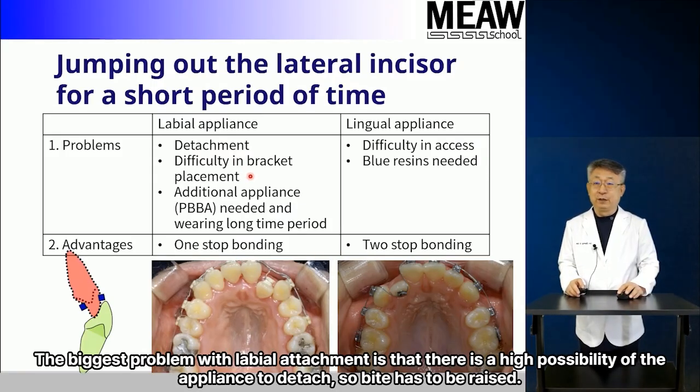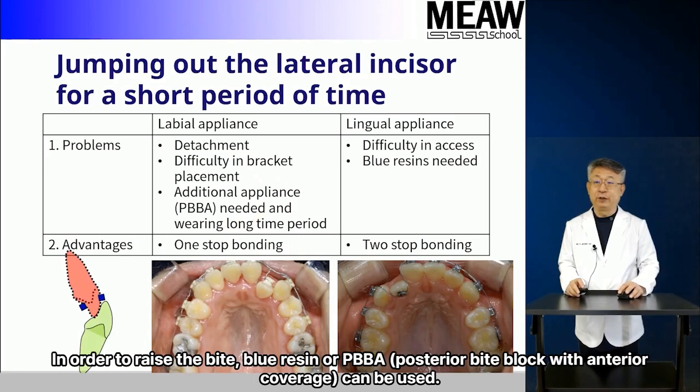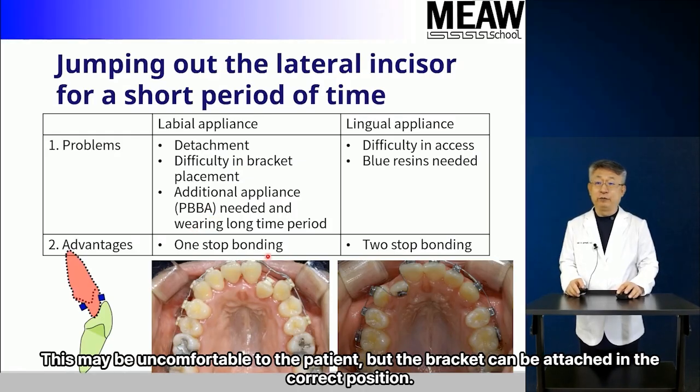The biggest problem with labial attachment is that there is a high possibility of the appliance detaching, so the bite has to be raised. In order to raise the bite, blue resin or PBBA, posterior bite block with anterior coverage, can be used. This may be uncomfortable to the patient, but the bracket can be attached in the correct position.